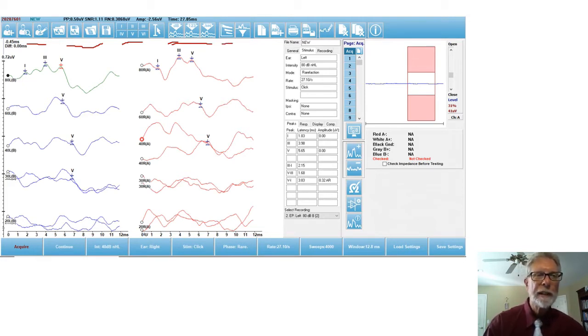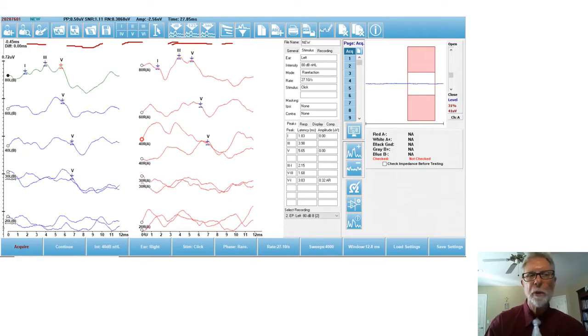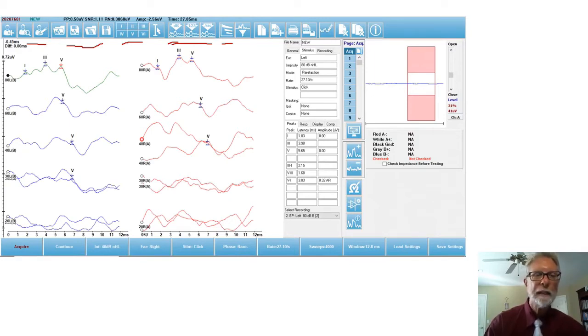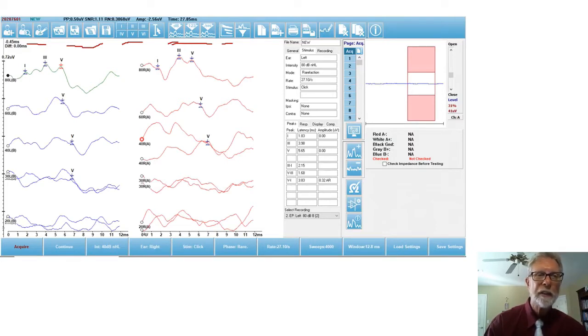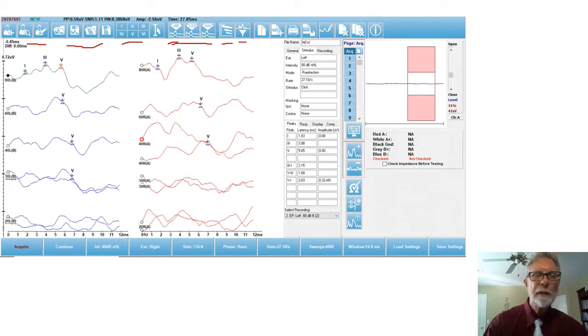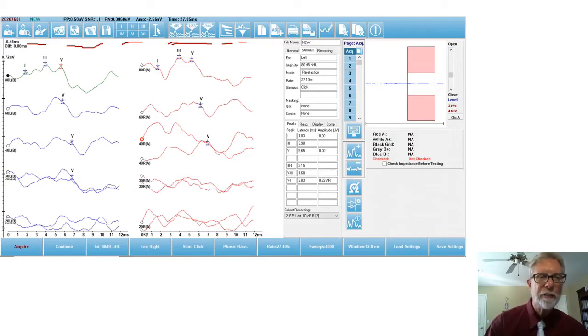So you just one click on that and the arrangement is automatic. This icon right here, I'll show you more detail on that in the next slide, but that's where you get your latency intensity information, latency intensity graphs. You want to apply a filter, you can just click there to apply a filter and I'll show you all the details about the filter.